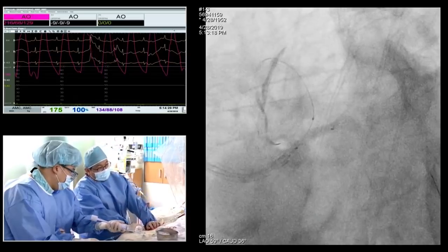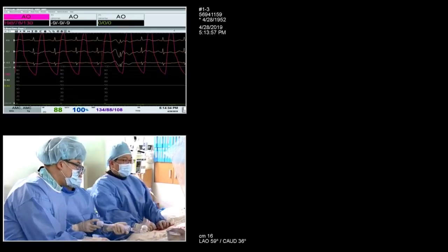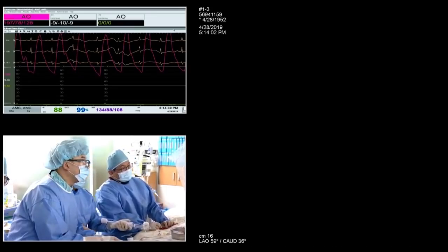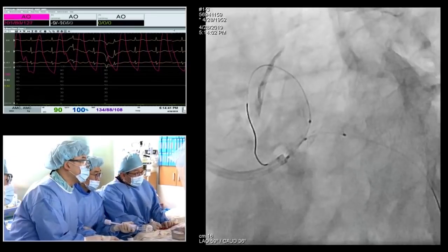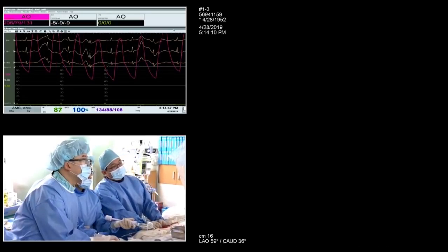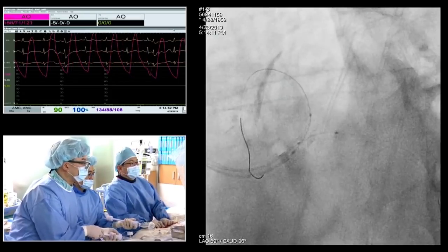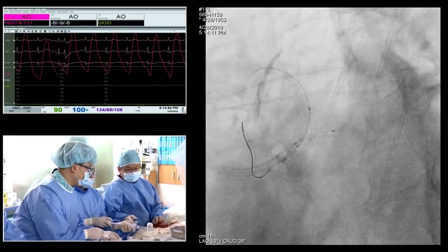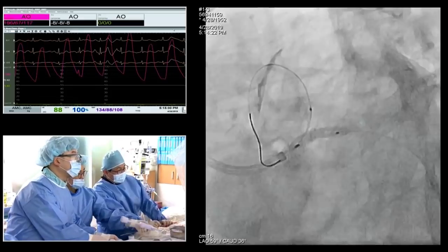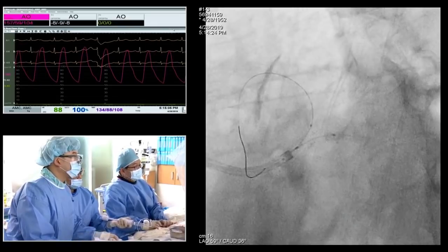12, 13, 14, 16, 18, 20. Deflation. 20, 3.24. Okay, 20. Deflation. Okay, great. 3.25 non-compliant high pressure for 20 again. Circumferential stent, circumflex. And then kissing balloon. Yes, final kissing balloon. And deflation. I can finish bifurcation within 20 minutes.